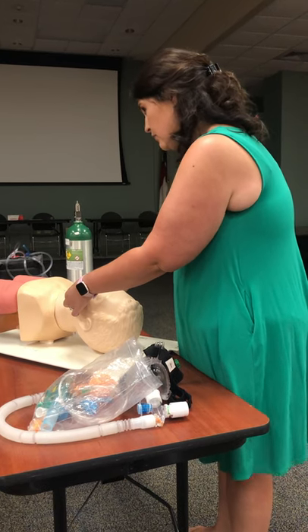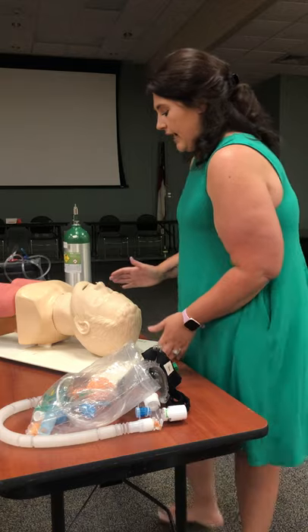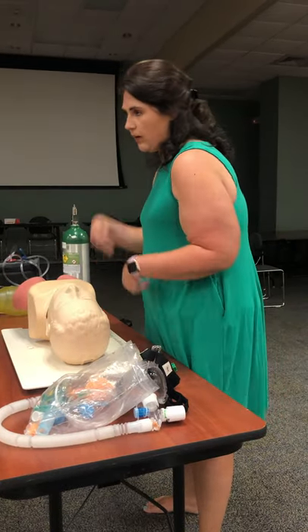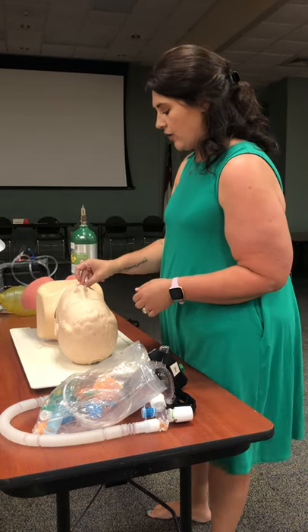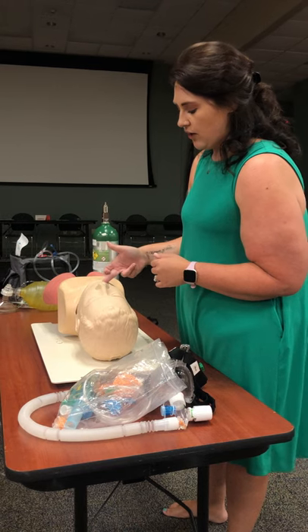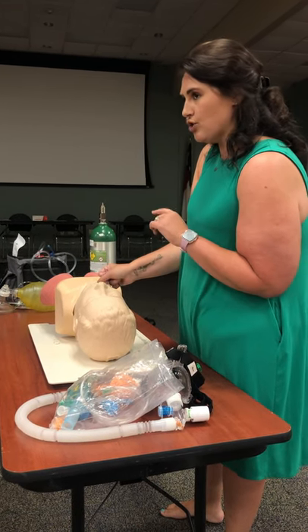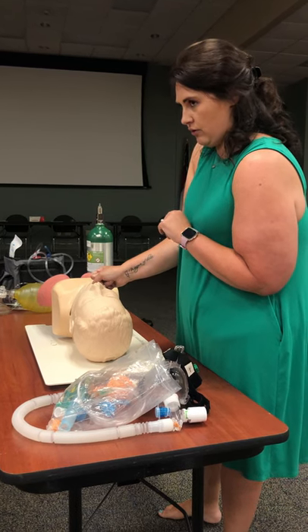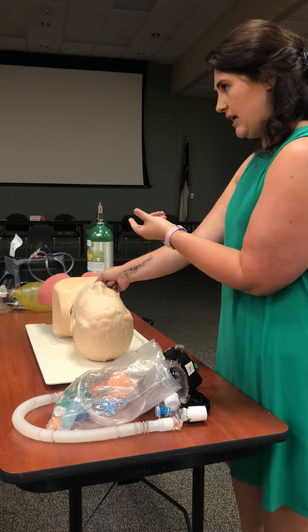The jaw thrust is difficult for you and painful for them, so the patient is likely going to be unresponsive. Unlike the head tilt chin lift where I could let go, I need to hold the jaw thrust for as long as needed. For the other two adjuncts, I'll use the cross finger technique to open the mouth — I put my middle finger on the top row of teeth, my thumb on the bottom, and push away from each other.